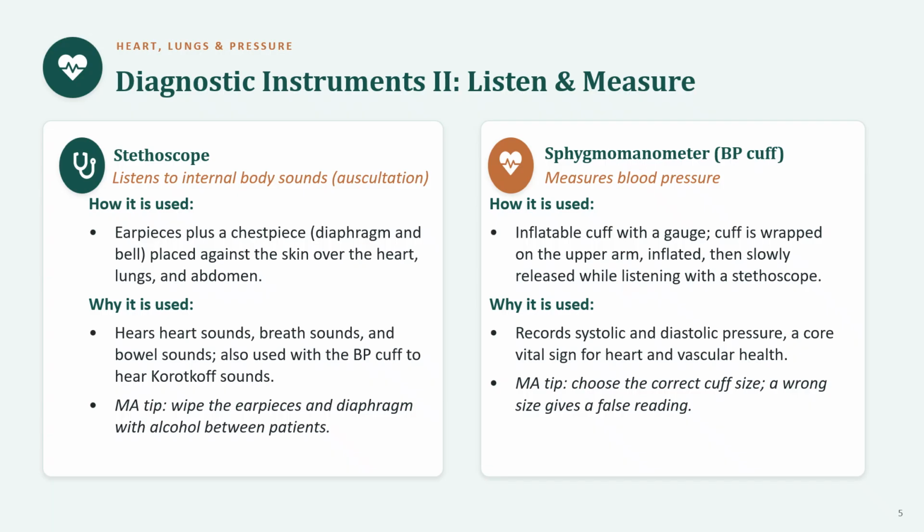Your tip is simple but important for infection control. Wipe the earpieces and the diaphragm with alcohol between every patient because that diaphragm touches a lot of skin.